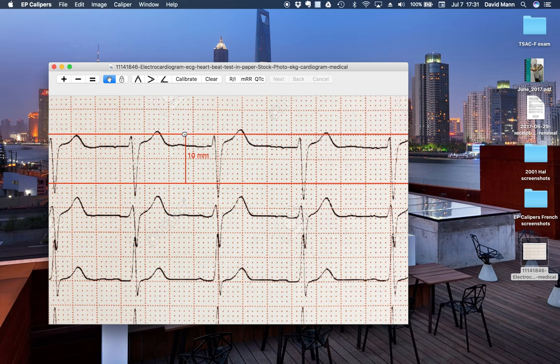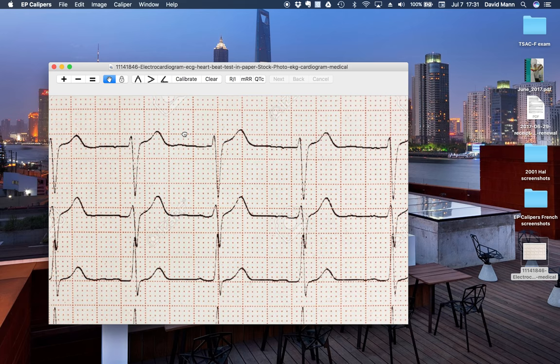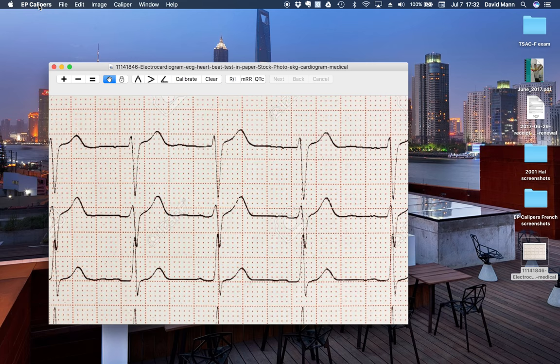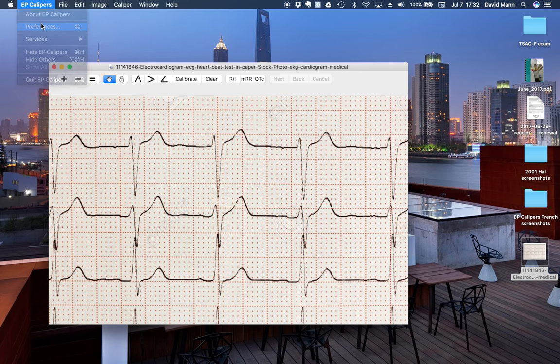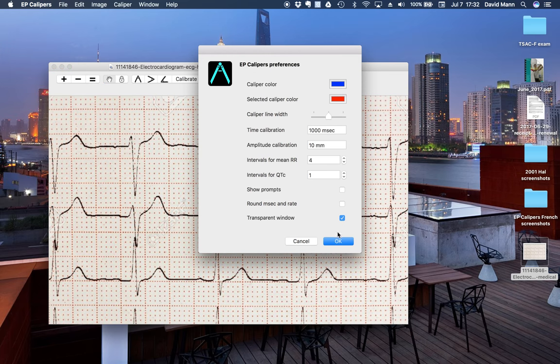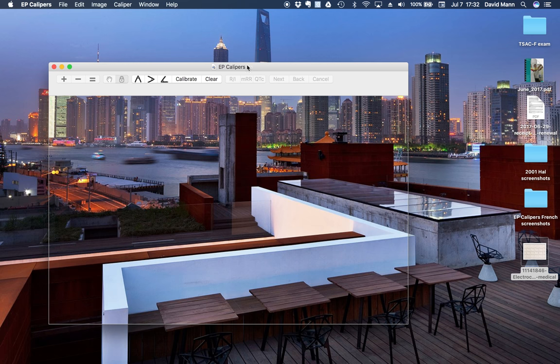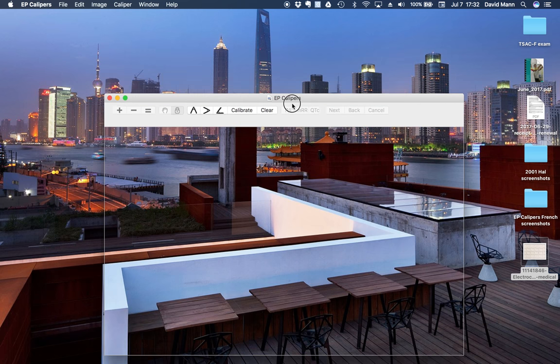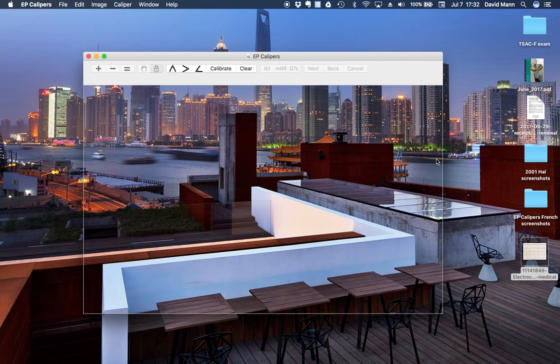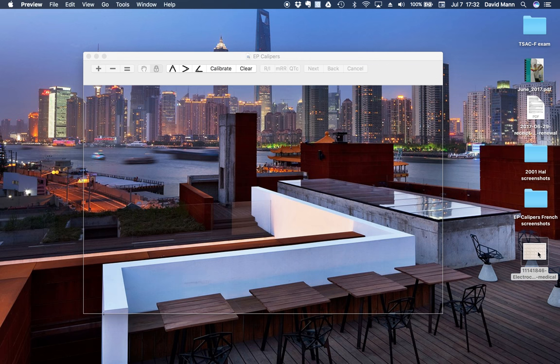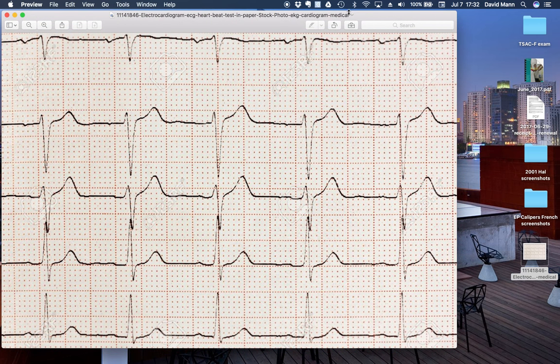Probably the neatest thing, at least in the laptop versions, the Windows and Mac versions, is that you can switch to a transparent window that floats. So we'll do that. And now we have a window that's floating over the desktop. So if we have a downloaded EKG like this one here, I can open it up.